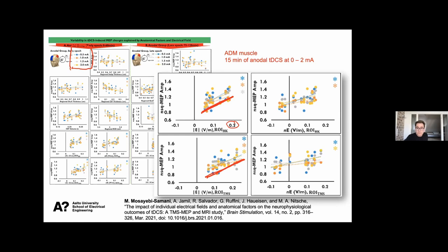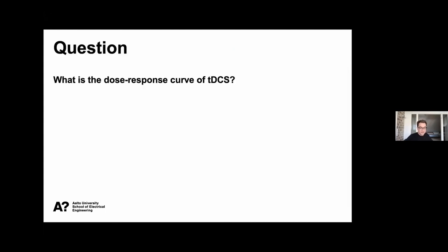So there is at least 1 study with a negative effect and 2 studies with positive effects. And there are also studies which have found no effect. So it is far from conclusive whether the electric field has any effect on the responses.